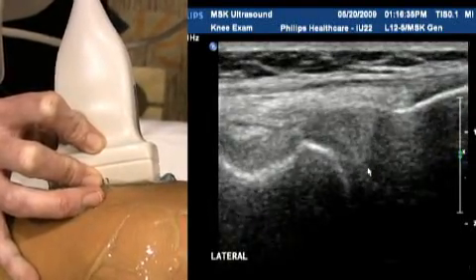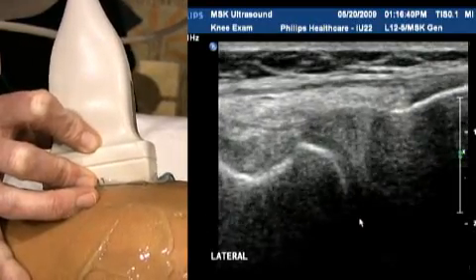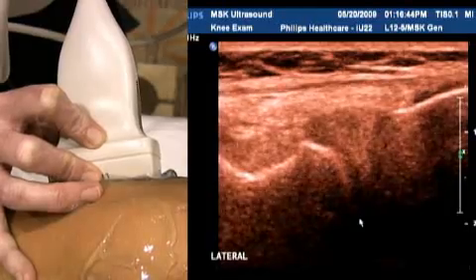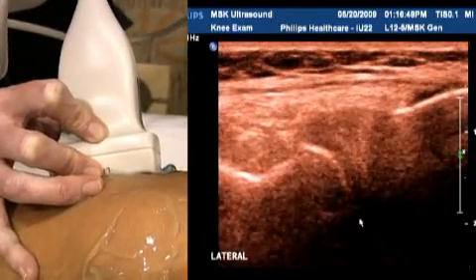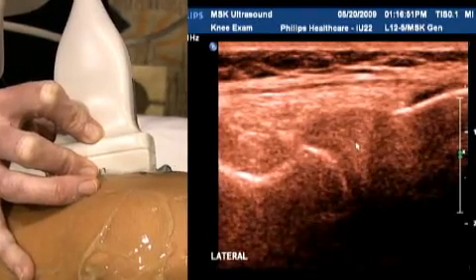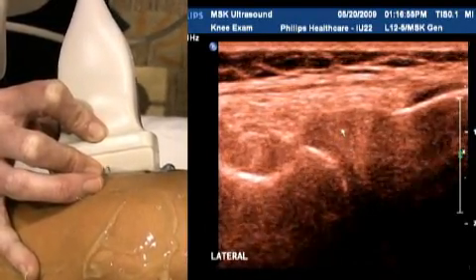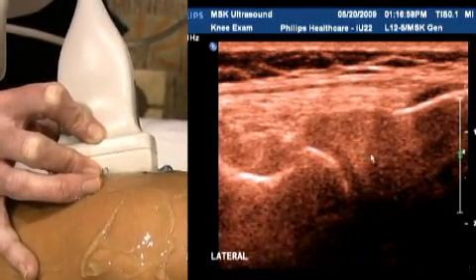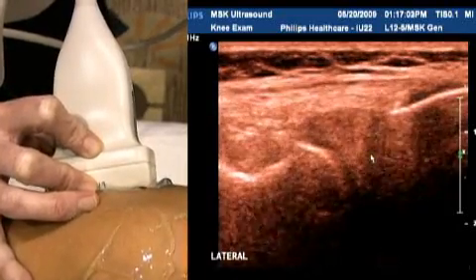Another trick you can use for looking at menisci in the knee is the chroma map. The eye is a little more sensitive to shades of colour than to shades of black and white, and so small meniscal tears — which appear as hypoechoic fissures in this echogenic structure — sometimes show up a lot clearer using the chroma. That's just a little trick to keep in mind.